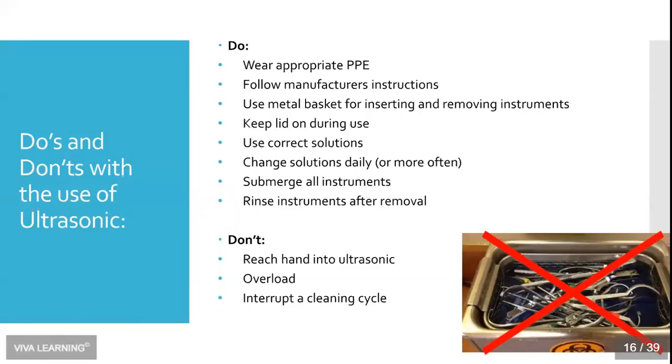Change the solutions daily, and some of these devices require changing more frequently than that. For instance, if you're in a high volume oral surgery practice and you've got lots of blood and bioburden in that chamber and you can see debris floating around, it's kind of like your dishwashing solution for a major holiday dinner. There's no harm in changing the dishwasher solution as you continue to clean your household dishes. There's no reason that you can't change your ultrasonic solutions as you are going through the clinical workday.